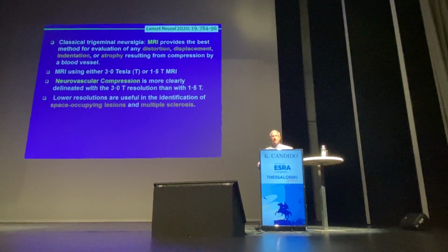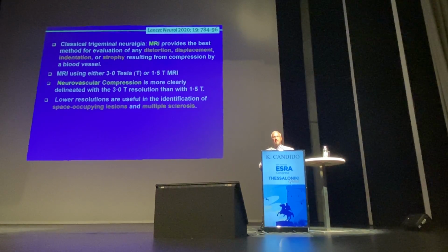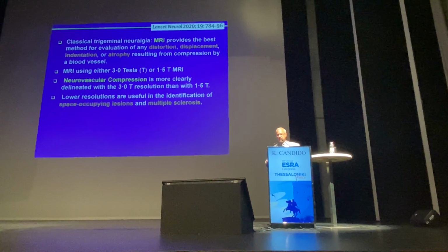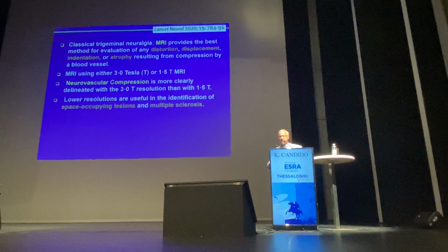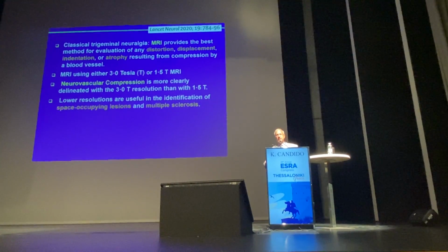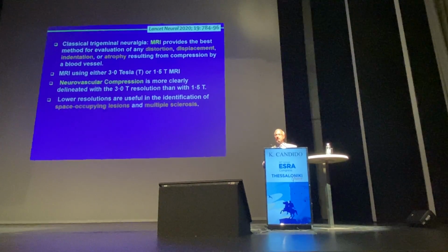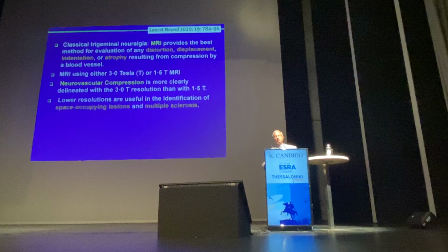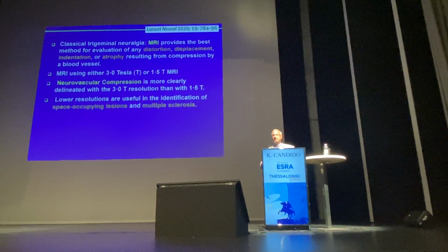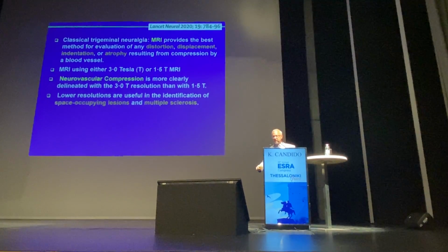And I would defer to some of the people in this room, for example, Dr. Naruz, who's got tremendous experience using ultrasound guidance for head and neck painful conditions, primarily for the therapeutic options available to us. But for diagnosis, MRI remains the gold standard. Now we have available to us multiple different technologies, Tesla 1.5 magnets or 3.0. 3.0 seems to be best for delineating neurovascular compression, and the use of lower grades of resolution. 1.5 Tesla appears to be very useful for things like MS or for identifying tumors, for example.